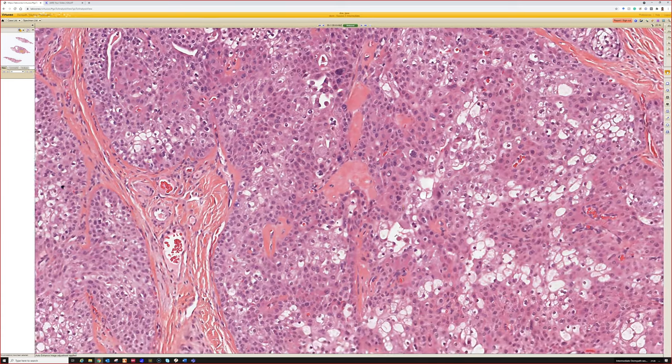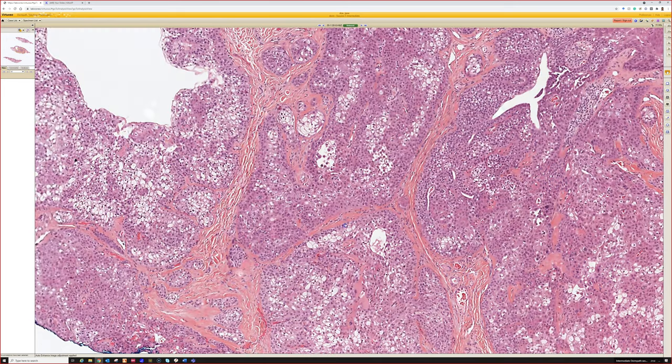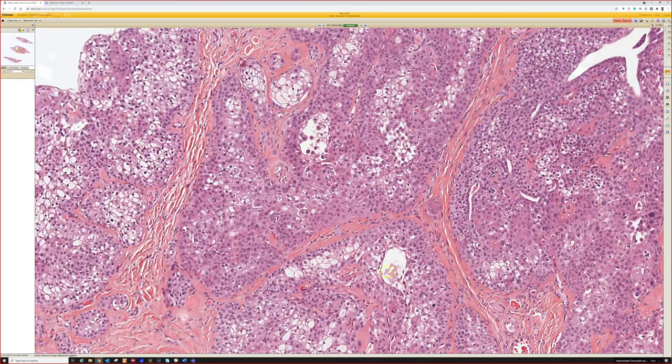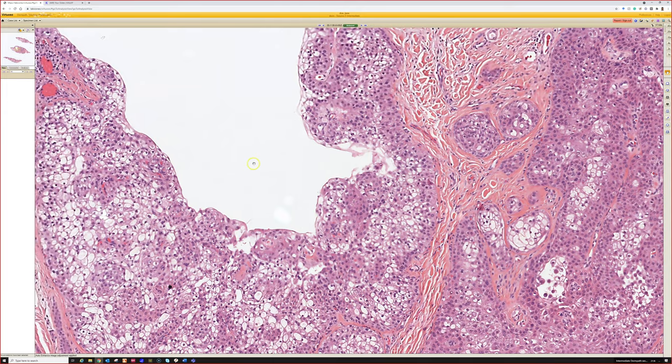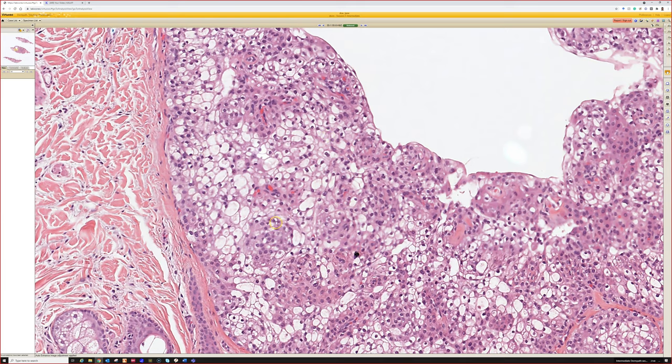So very much they're a pink tumor, not a blue tumor usually. And more duct spaces here and here, and then big dilated cystic duct spaces. And these are the areas where you start seeing all of this clear cell change. You know, if you're having a bad day, you could think, oh, that might be a renal cell.